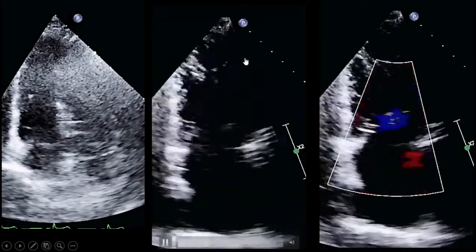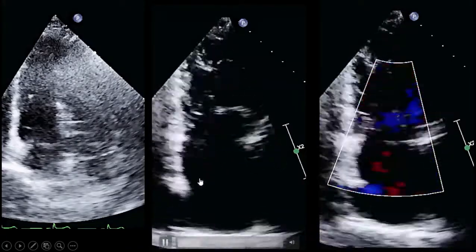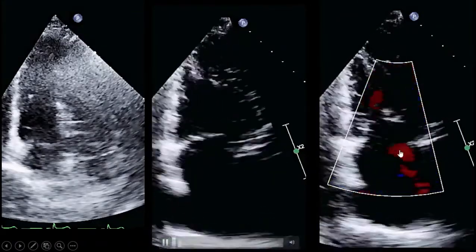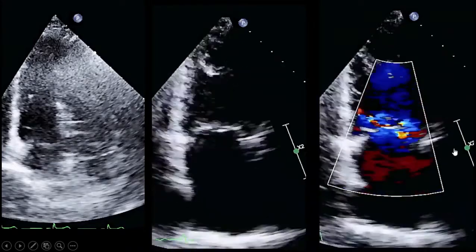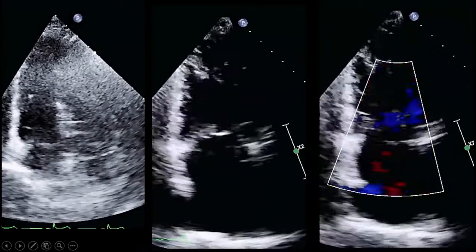because this patient was being evaluated for pulmonary hypertension, and we need a very clear TR, I went the extra mile and got this one. You will see two different, very clear and prominent jets on the tricuspid valve, as you see.